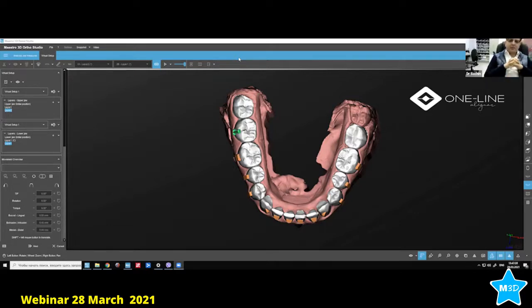Yes. Okay, so if I have understood the question right, the question is whether we can decrease the thickness on the posterior side, right? Yes. So if you want less posterior thickness, one easier way is to make the model on the posterior a little bigger, the base bigger, so the posterior is bigger and the anterior is smaller. When you do thermoforming, the posterior thickness will be less, but there is no control.